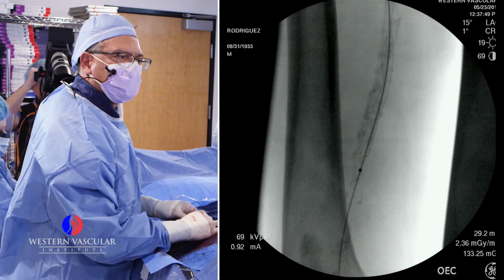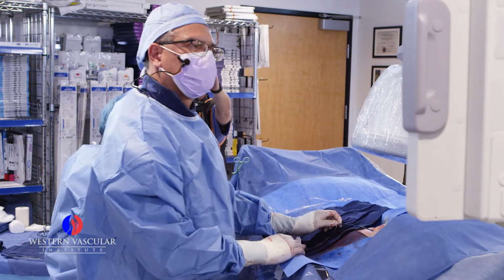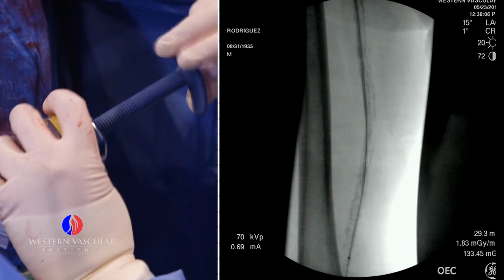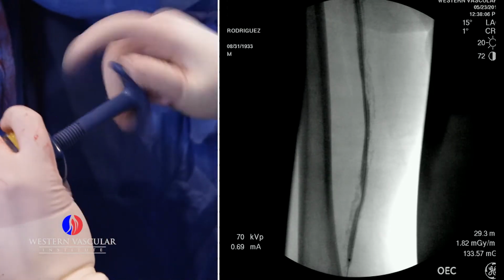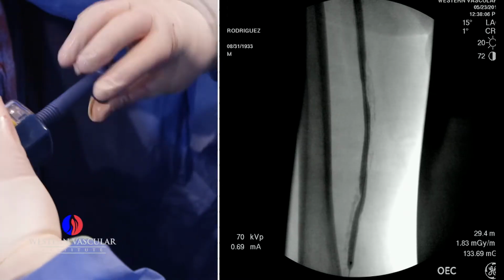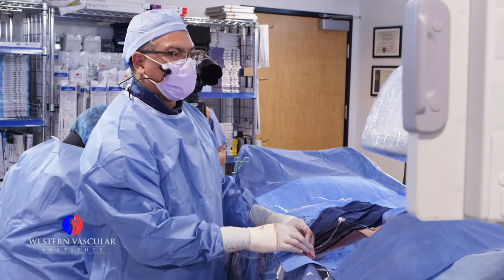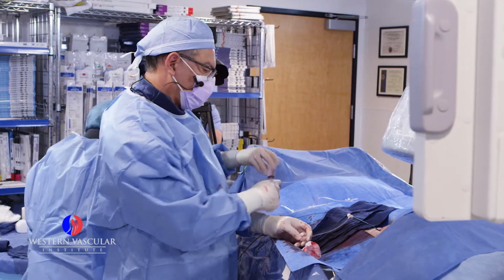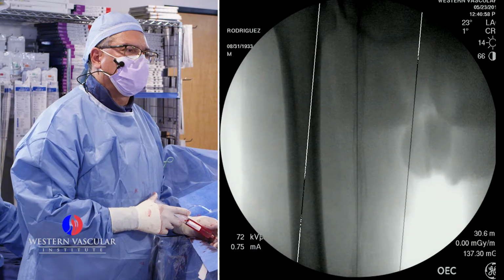Okay. Let's get it out. So we're going to 14 atmospheres. Yeah, you can tell the area is very stubborn. It's okay, down. All right, we're going for the final picture here. So let's start at the top. So the first picture is the upper thigh.